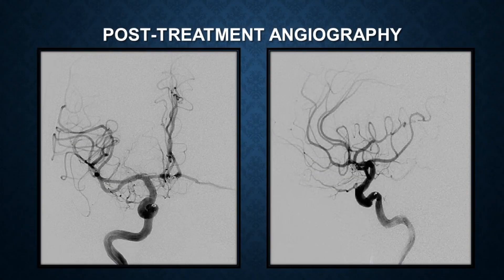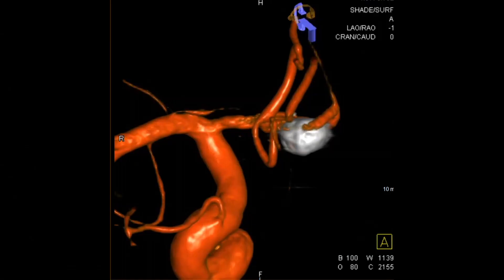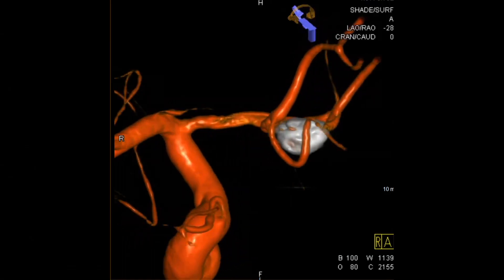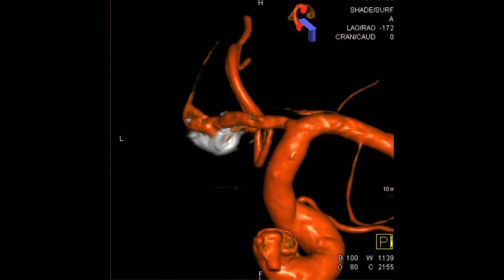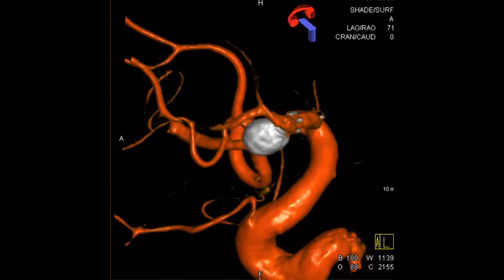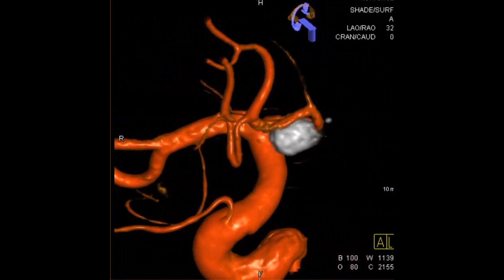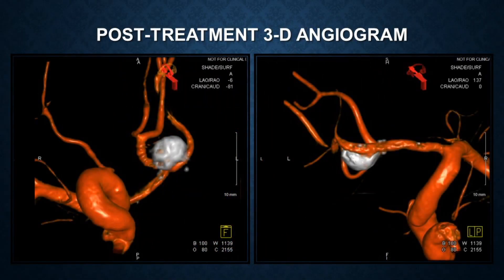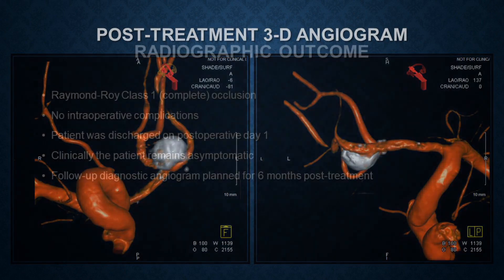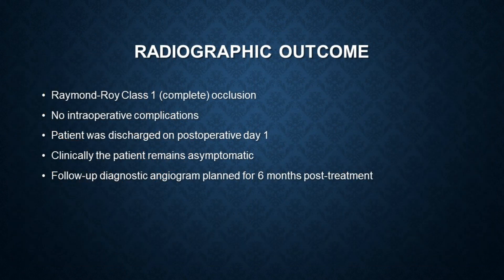The post-coiling angiogram shows complete obliteration of the aneurysm, confirmed by 3D angiography. The patient did well post-operatively and is pending a delayed angiogram at 6 months. Her clinical course has been benign, as she has followed in clinic.